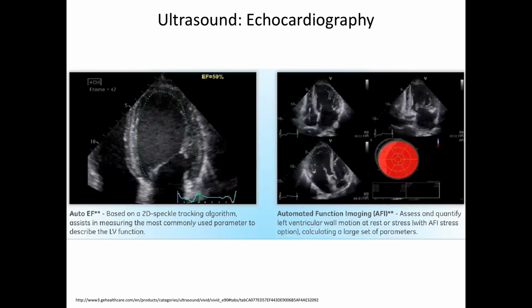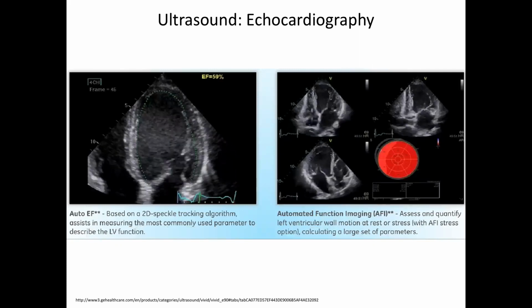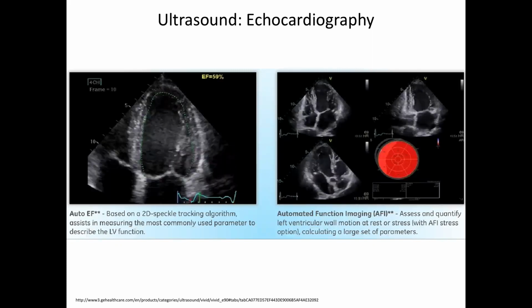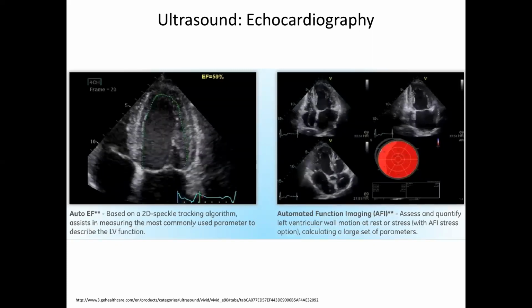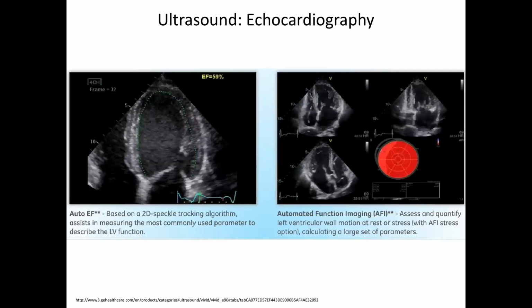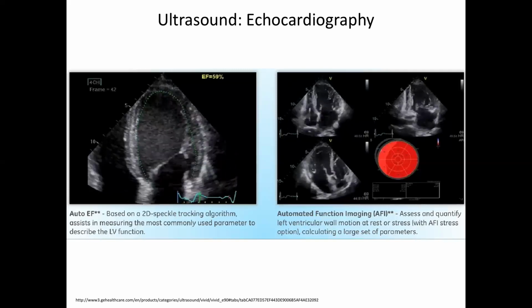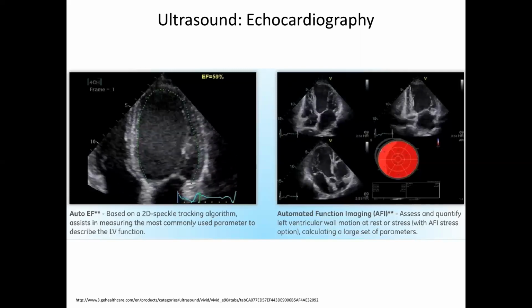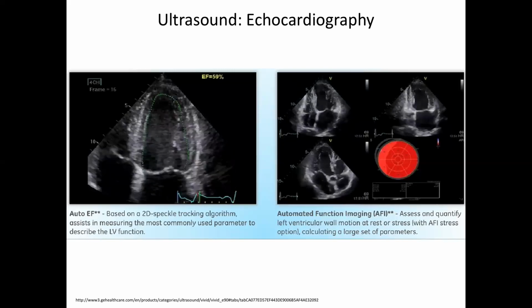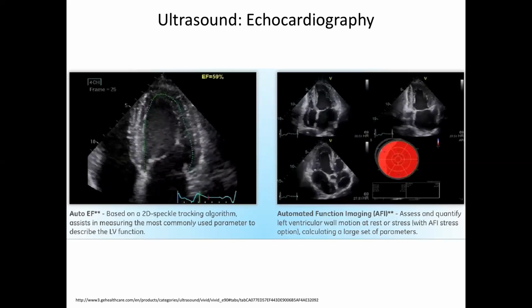In ultrasound, that's really tough because the signal itself has fairly low signal to noise, right? And so you'll find a lot of errors if you just let it go automatically. So humans are a big part of drawing these contours. And it doesn't work worth a damn for figuring out what the change in function is. If you're looking for a small percentage change, like 10% or something, you can't see that when you draw these contours, because you get 10 people to draw the contours, you get 10 different answers. Right?